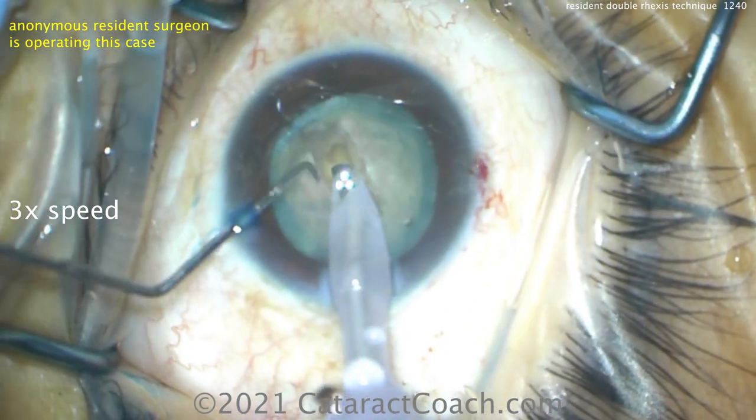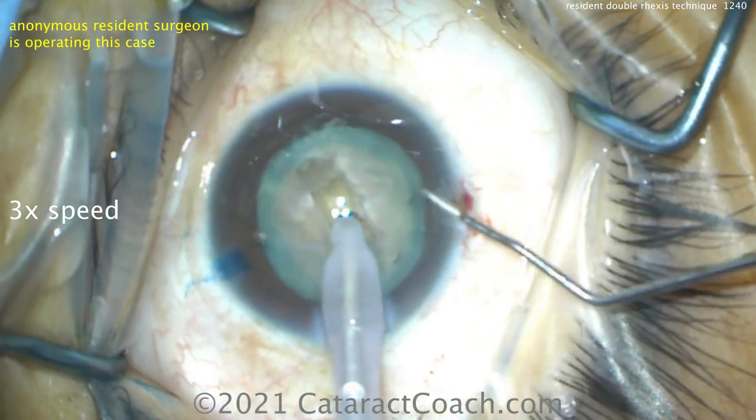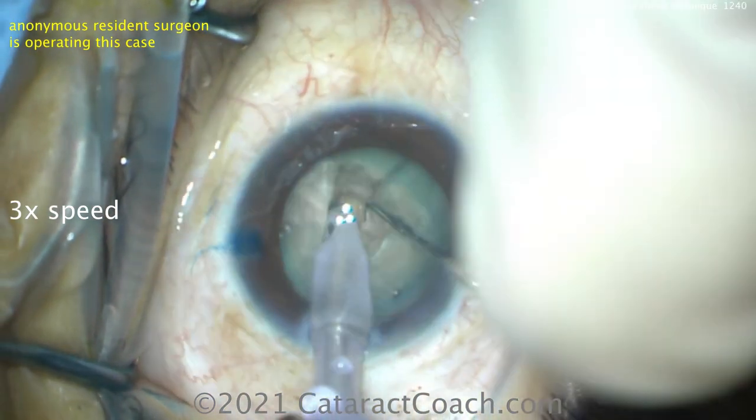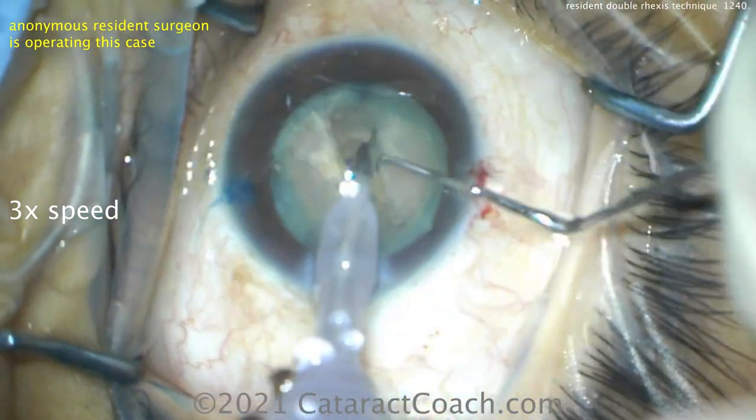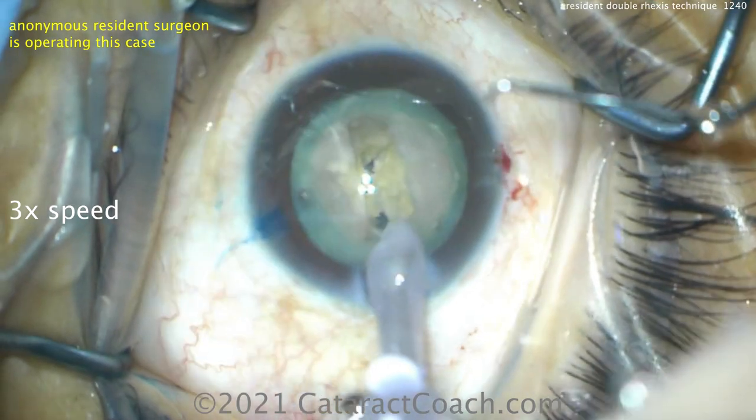Good split. Didn't propagate through yet, then we're going to get some help from the other side. There we go — there's the split. Again, a little bit of fibrous nature to this, make sure it's fully separated. That was great — that was probably me going through the other side port.